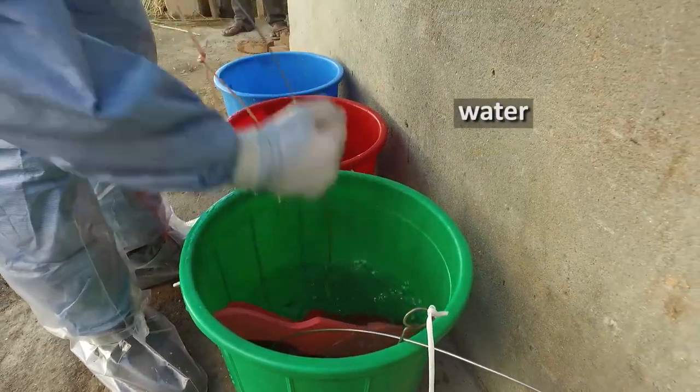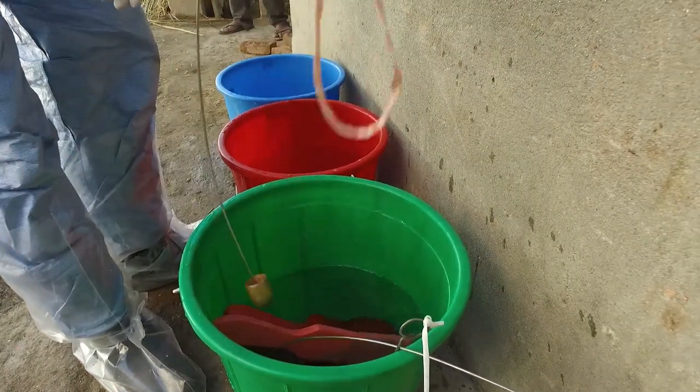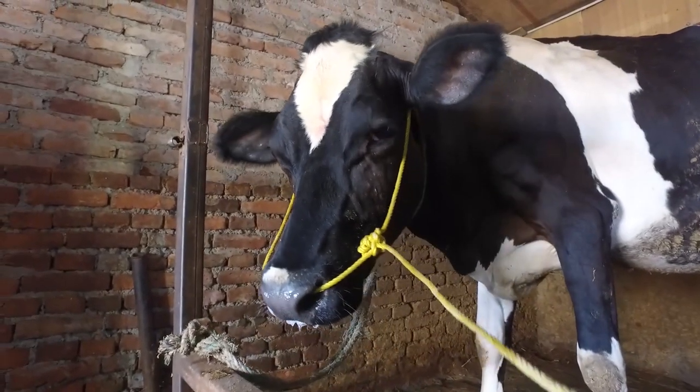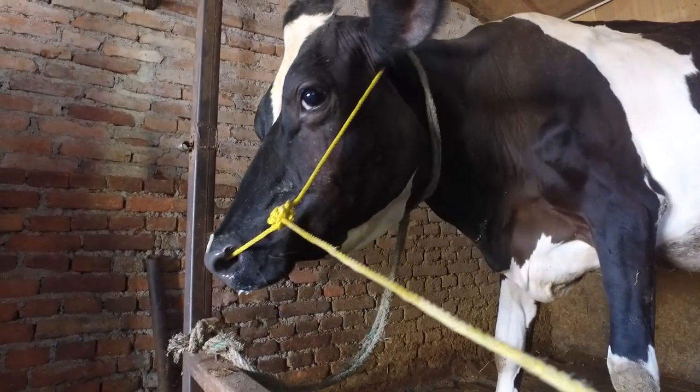If the probang sample contains ruminal contents it is not suitable. The animal should be left for ten minutes and then a second attempt can be made at sampling.